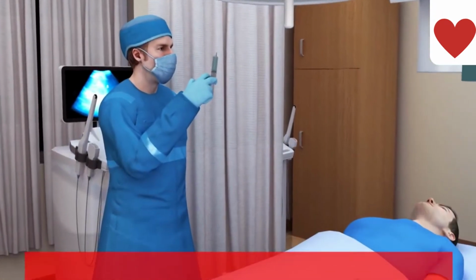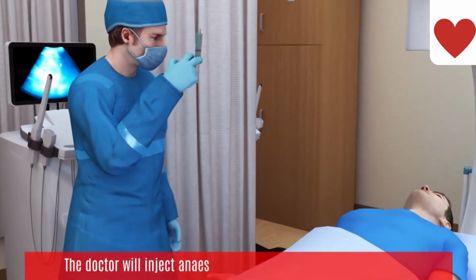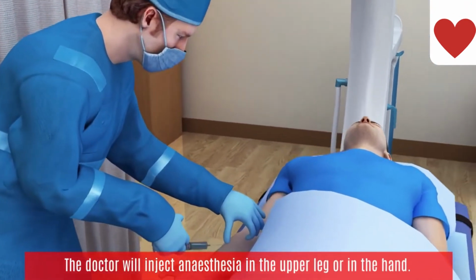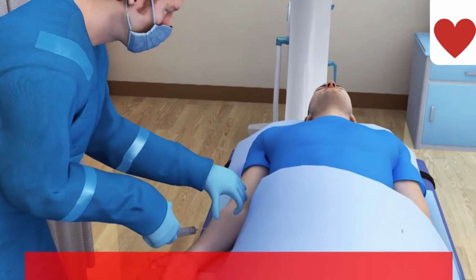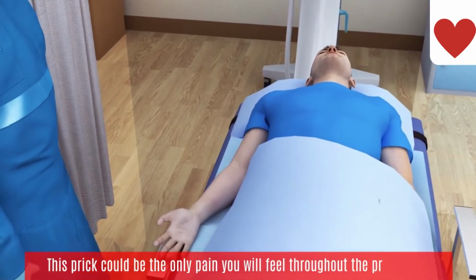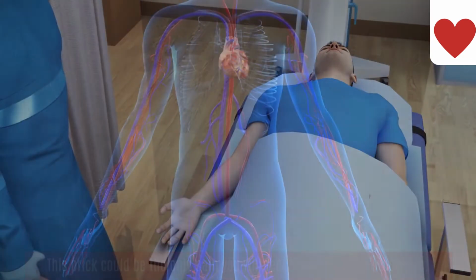The doctor will use a small needle to inject anesthesia in the upper leg or in the hand. This makes you numb but doesn't make you sleep. This needle prick could be the only pain you will feel throughout the procedure.